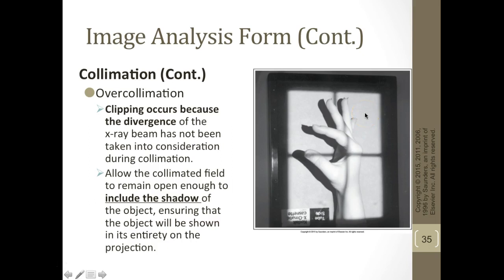If you guys are anywhere but UCSD, because they hang their hands anatomical, which is backwards from everyone else, you can slide your marker in right there, or you can put it down here and just collimate in nice and snug.